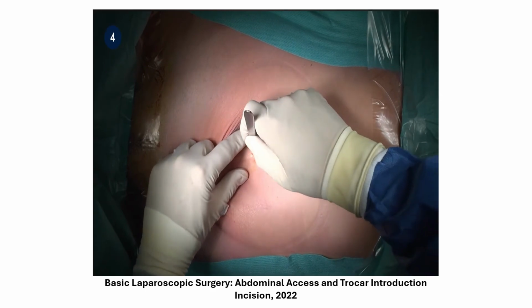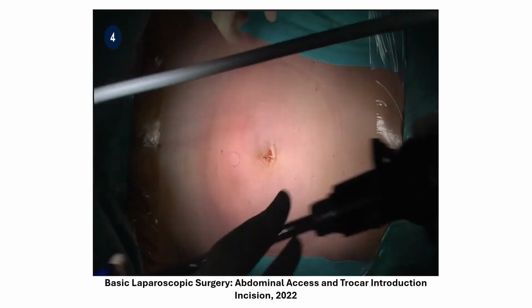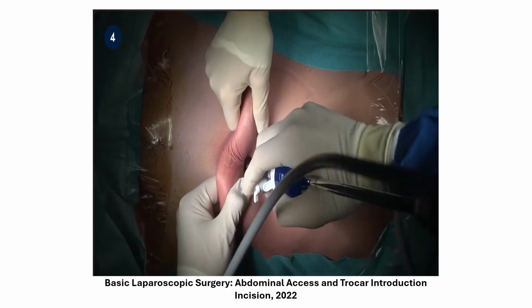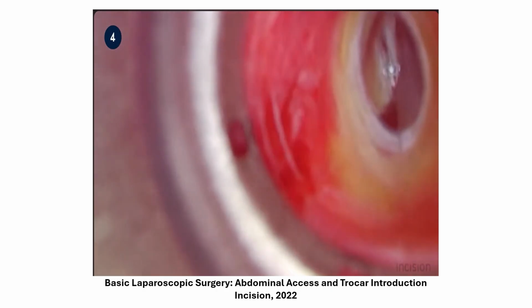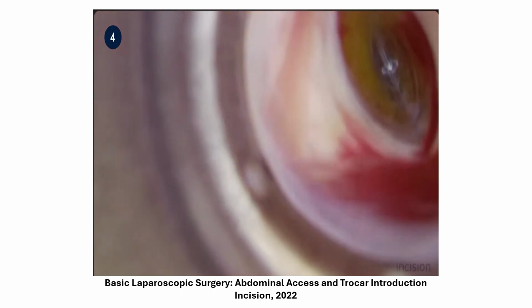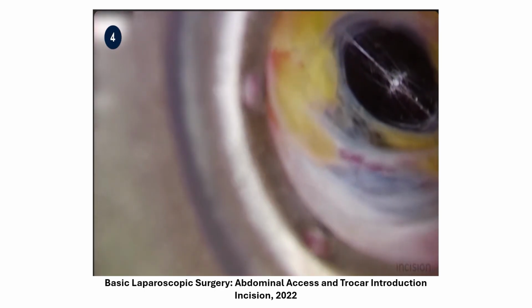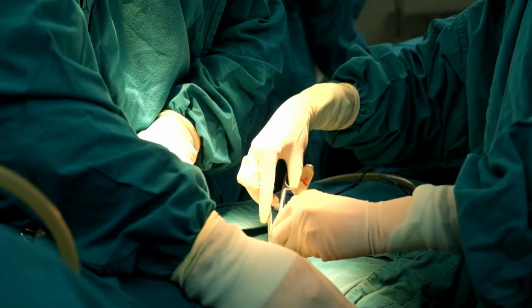So again, we make that initial incision, and then there's the laparoscopic camera with the optical trocar. We're going to bring up that abdominal skin, create tension, and then we look back at the monitor and we can see all the different layers that we're passing through. And once we go deep enough through these layers, we gain that abdominal access and we can begin insufflation of the abdominal cavity. And that's a wrap on how to gain abdominal access for laparoscopic surgeries.